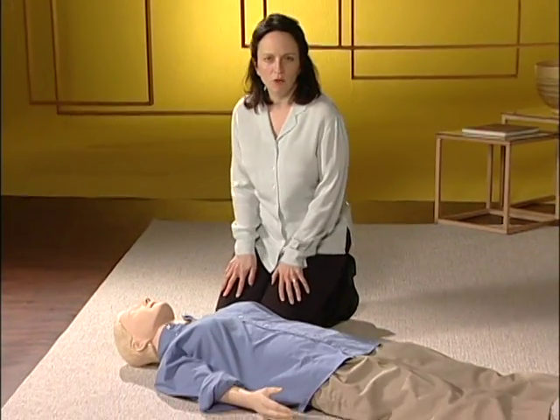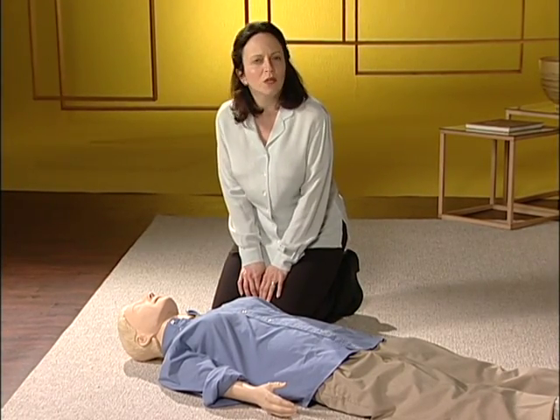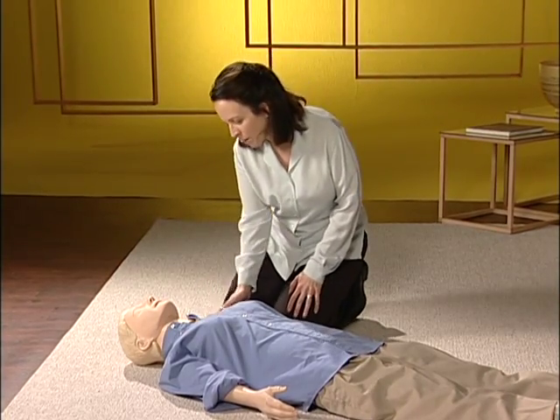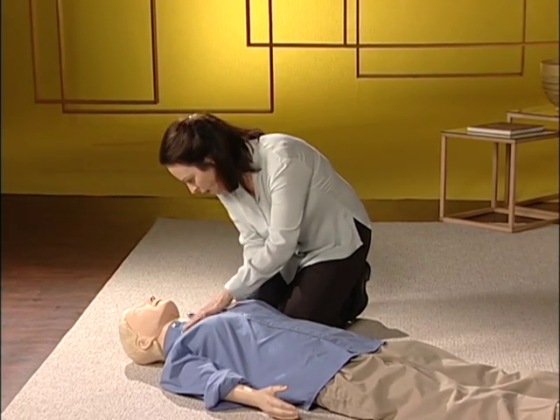Someone in cardiac arrest is unconscious and not breathing normally. They might not be breathing at all, or they might be gasping, or what seems like snoring. The first thing you should do is try to wake them by tapping or shaking their shoulder and calling out, "Are you okay? Are you okay?"